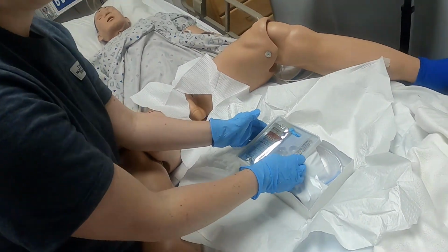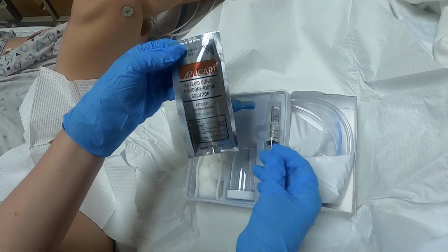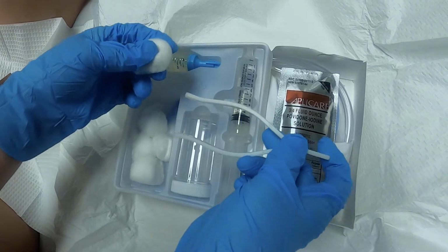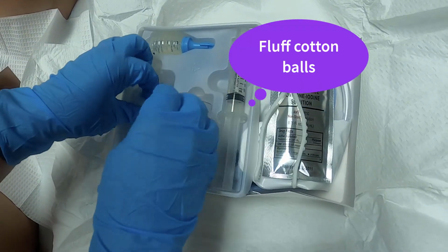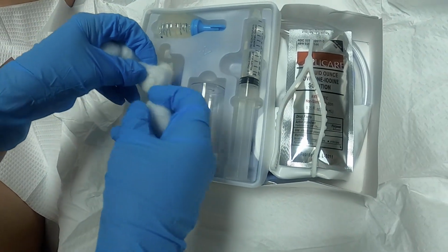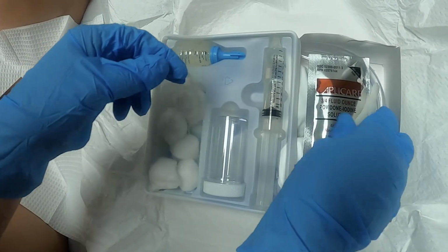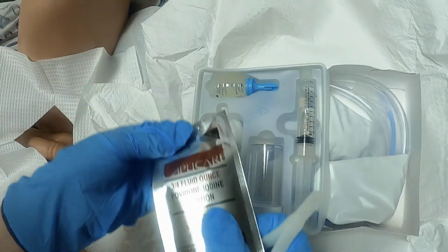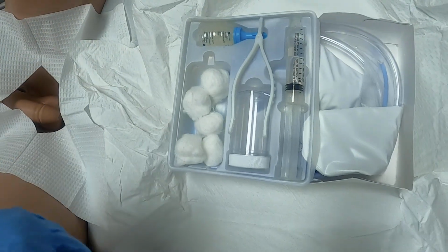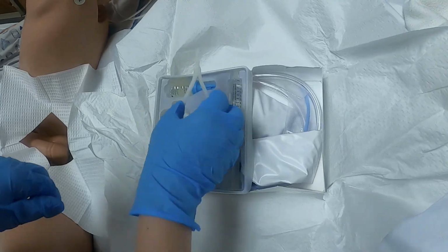So what you need to do is assemble everything. So here's your iodine solution, right? I want you to always, if you have cotton balls, fluff them apart first. Otherwise they will stick together. Here we go, we fluffed them. Now you would go ahead, open the iodine and spread it all over it. Okay. So now I'm going to toss this into my trash, right?